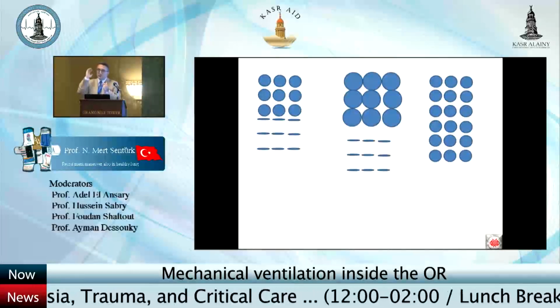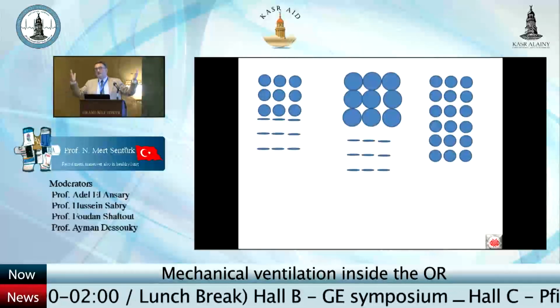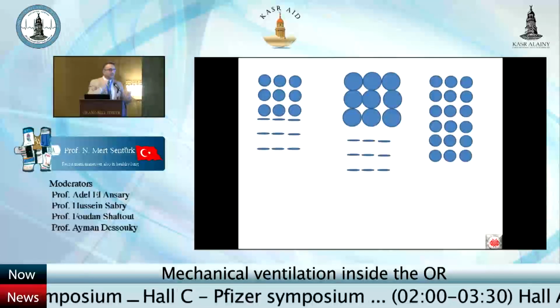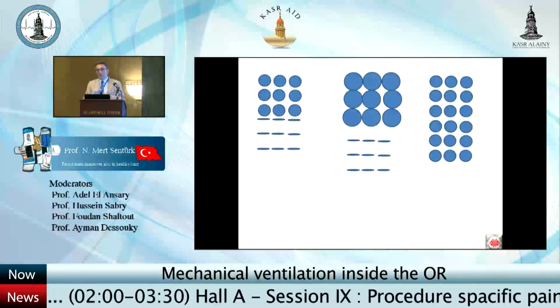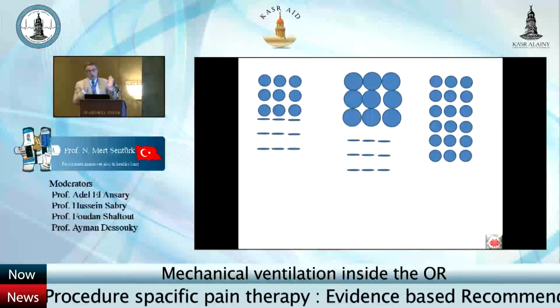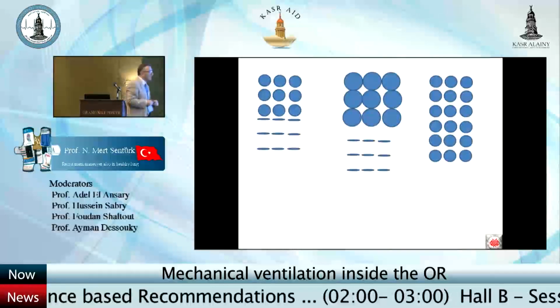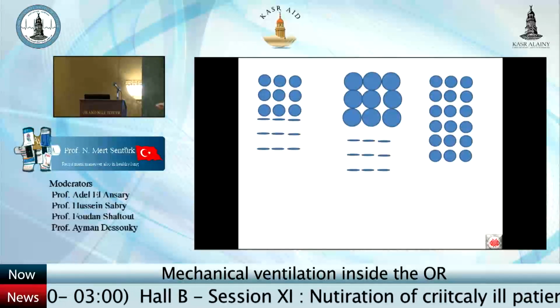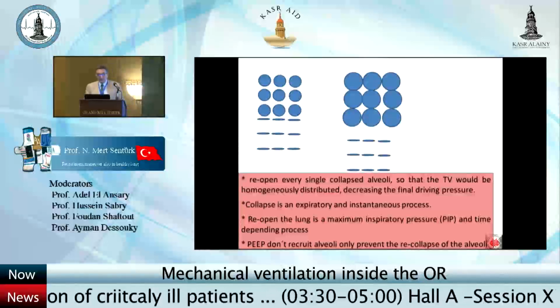Now I have to find something for the rear seats, and I have to just scream, hey! This hey is a recruitment maneuver, and this wakes the people who are a little sleepy. And this would not harm the people in the front seats. This is the recruitment maneuver, the way to wake the sleepy people, the collapsed alveoli here, to open these alveoli.